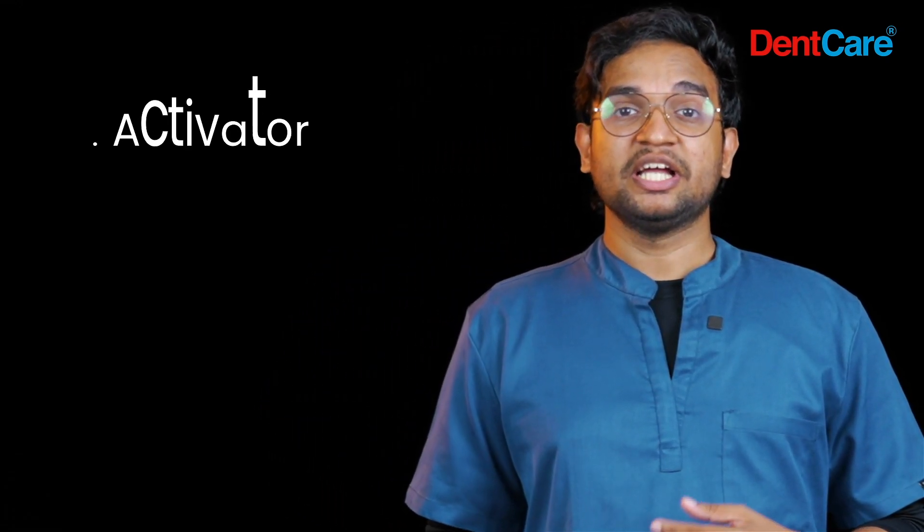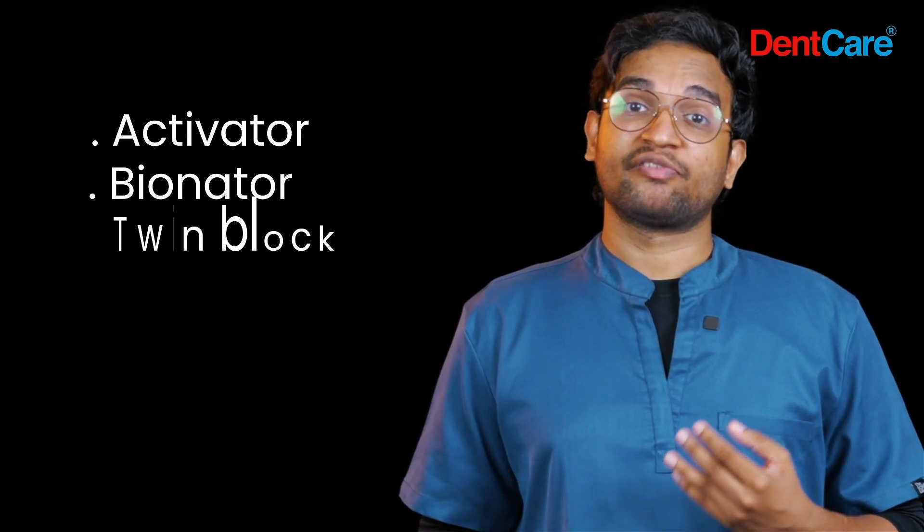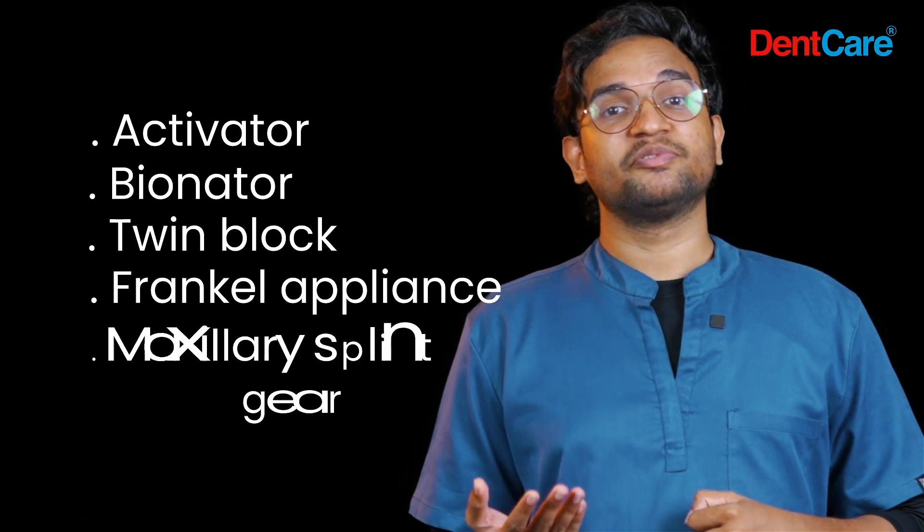At Dencare, we provide a variety of functional appliances including Activator, Bionator, Twin Block, Frankel appliances, and Maxillary splint with headgear.